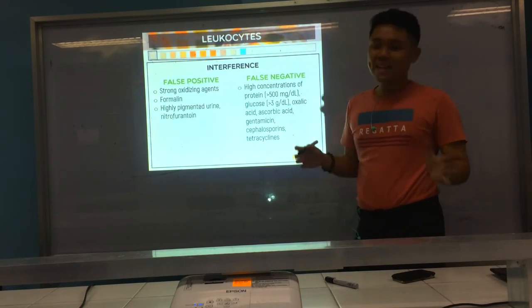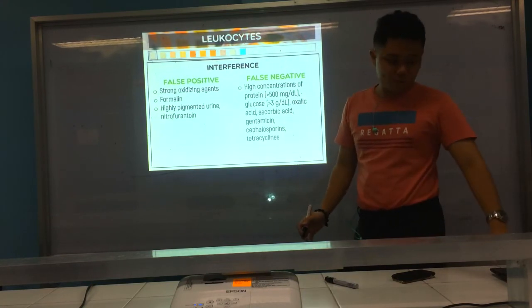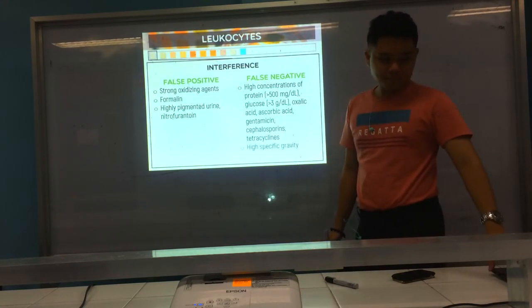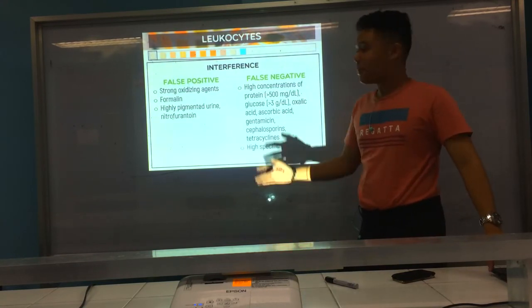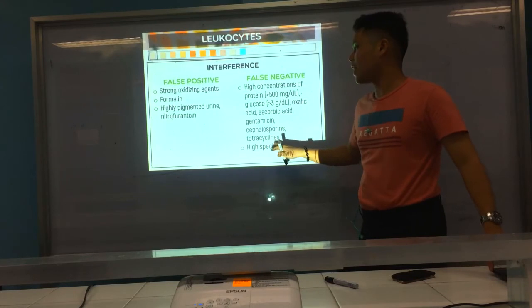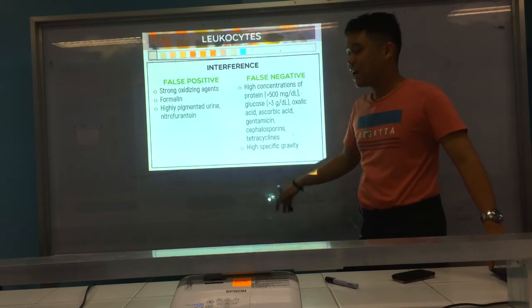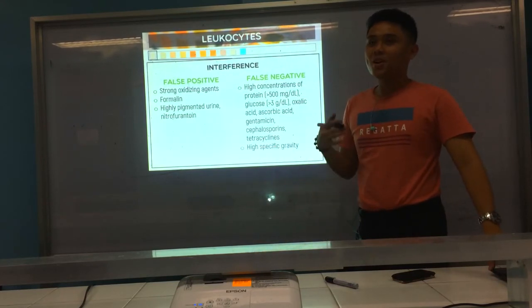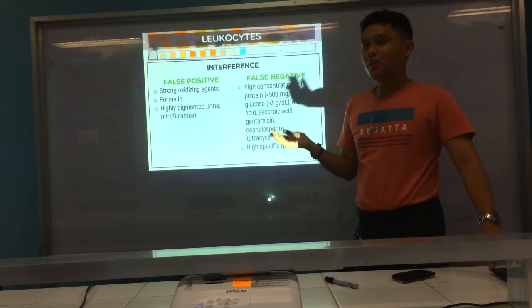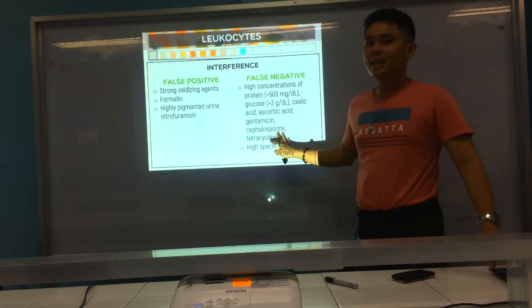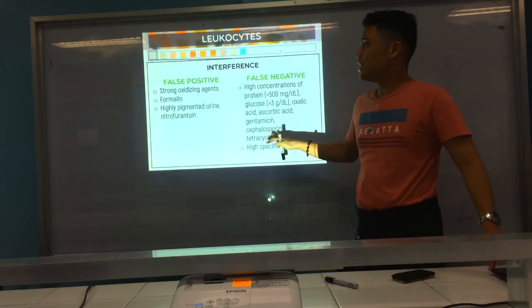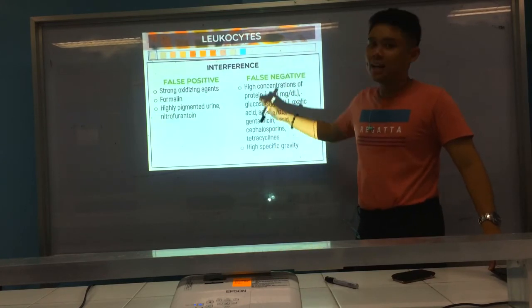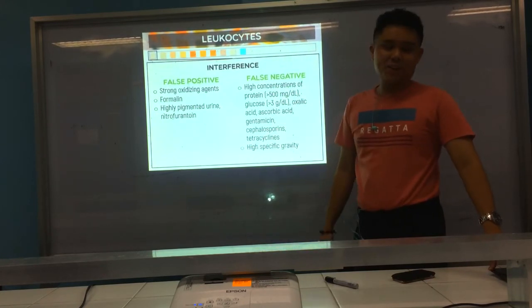Ascorbic acid competes with the diazonium salt, hence causing a false negative result. High specific gravity also gives low sensitivity, as too many other solutes prevent detection of leukocyte esterase.